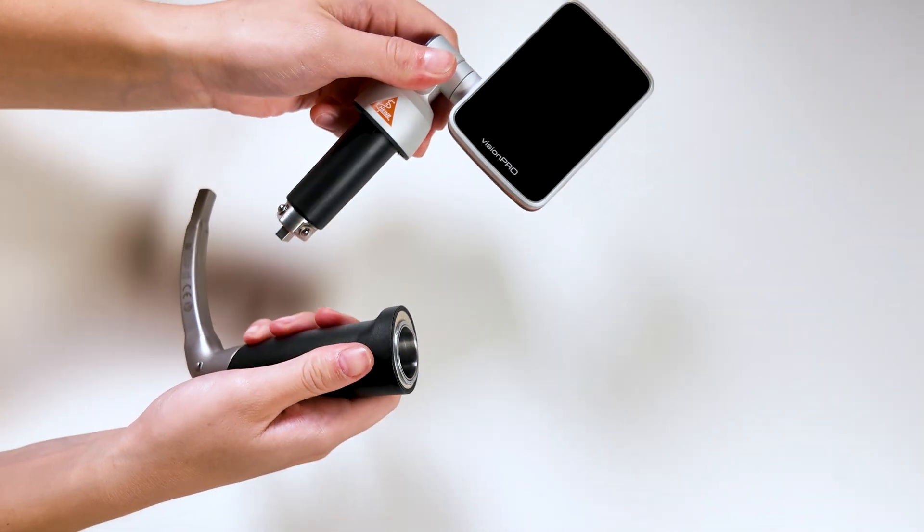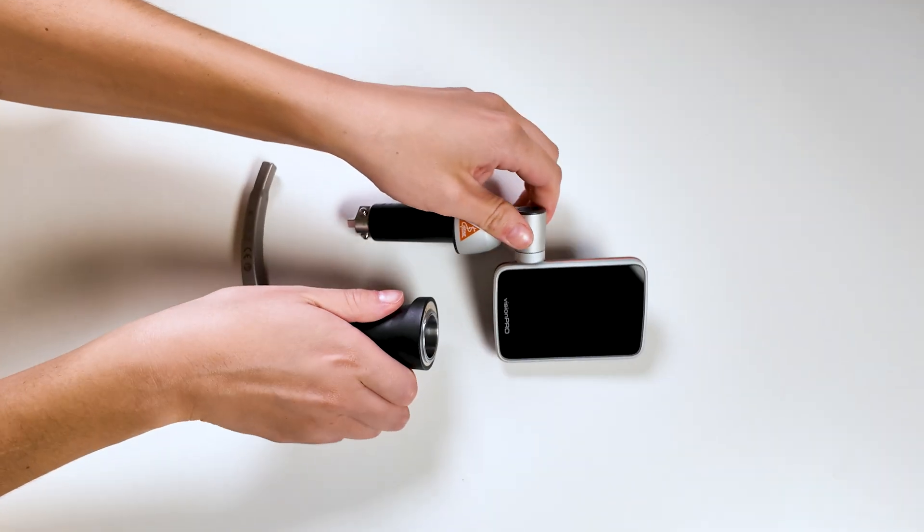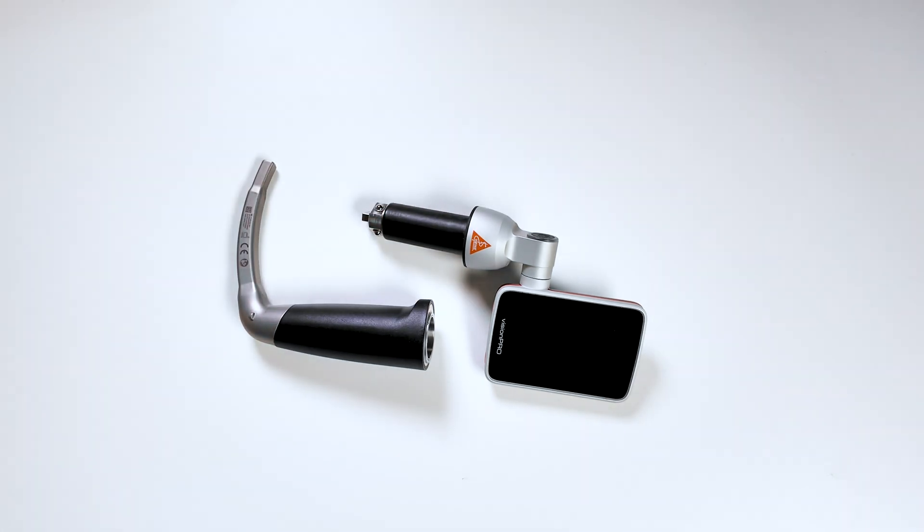The Vision Pro comes with a rechargeable Li-Iron cell located within the display unit. Starting at 100%, the battery provides around 4 hours of continuous operation. This corresponds to approximately 50 intubations including preparation, each of them taking 5 minutes.